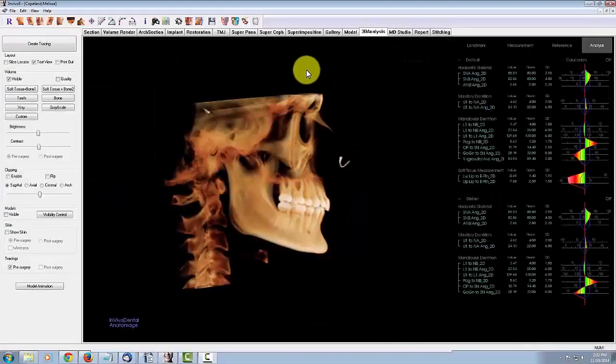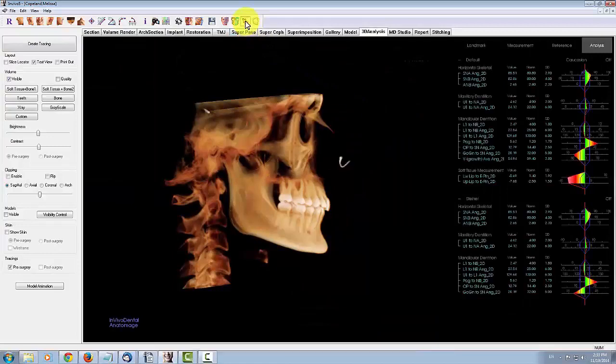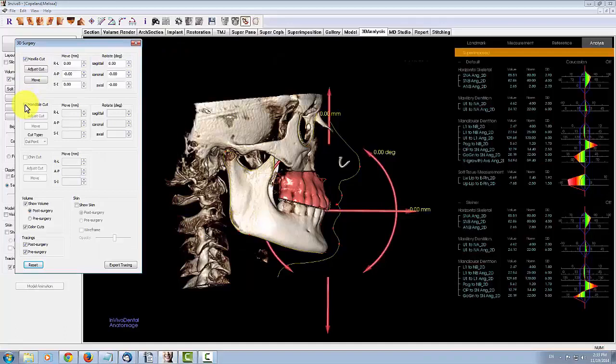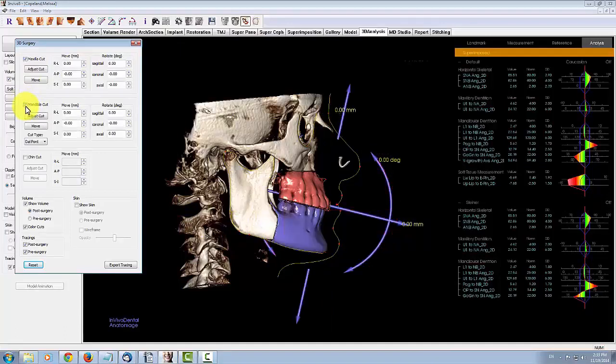Once you have traced the patient scan and placed the appropriate landmarks, you'll be able to use the software's automatically generated maxillum, mandible, and chin cuts. By checking the box next to the cut label, we can view these predefined cuts.